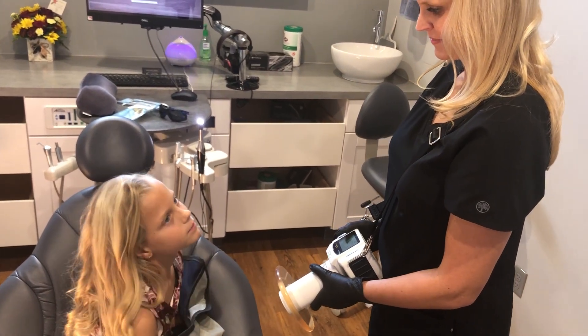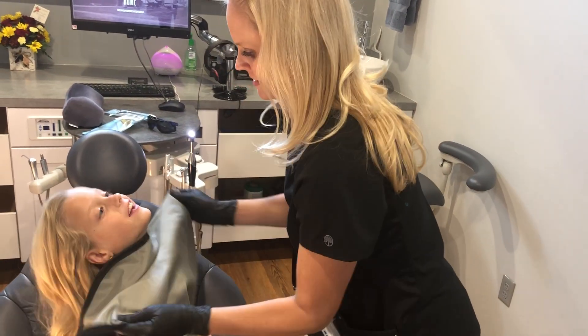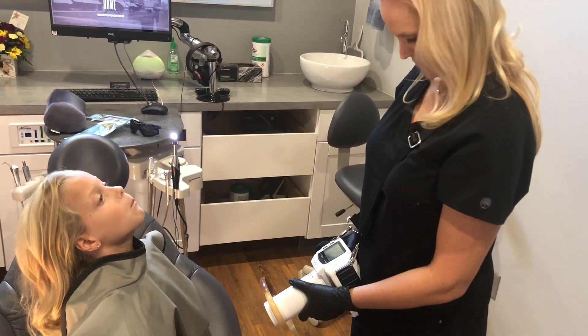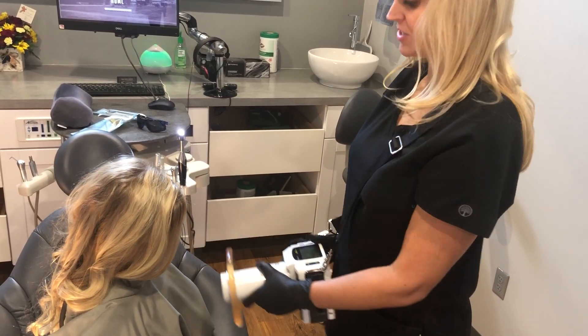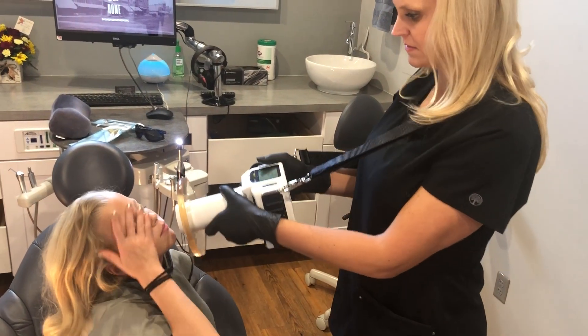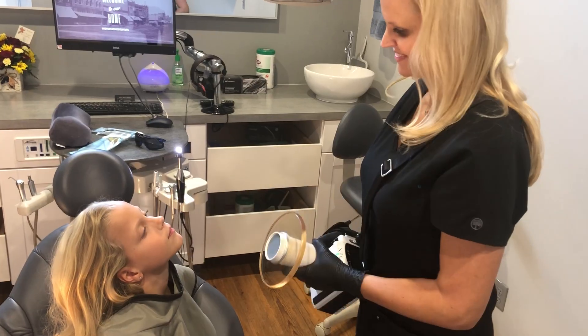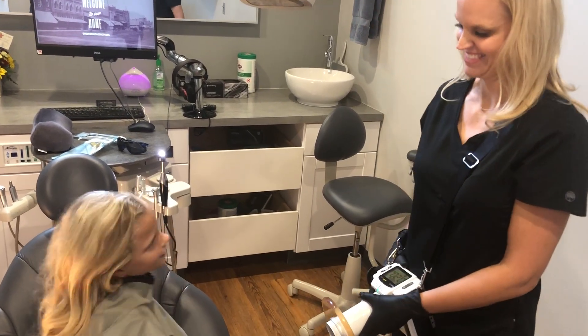Show them one more time the proper positioning. With our apron — that's the slip and slide on our apron here — sit nice and tall and put your chin down. Then nice and tall and put your head up. Nice and straight. Completely protected; back's got a shield.